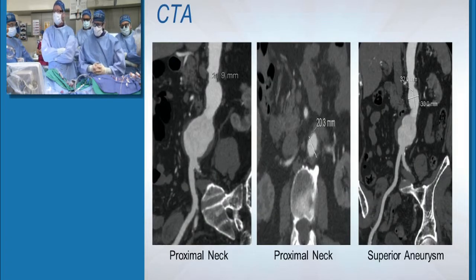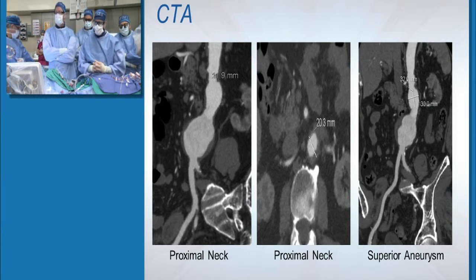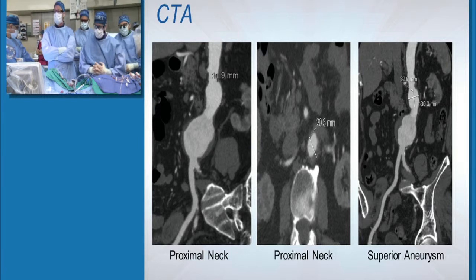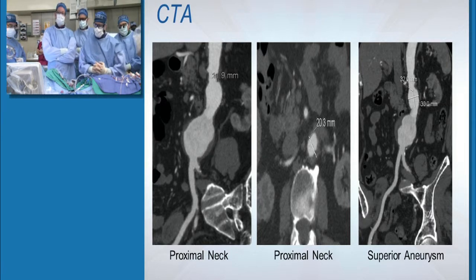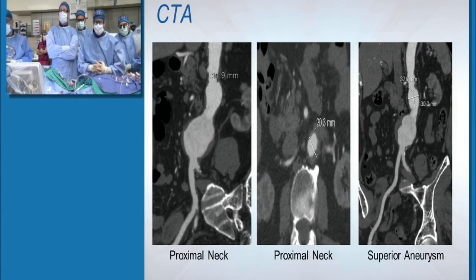A couple of curvilinear reformatted images showing a short proximal neck. You can see that bilobed configuration to a little bit better advantage. And then some images of the proximal neck and the superior aneurysm.